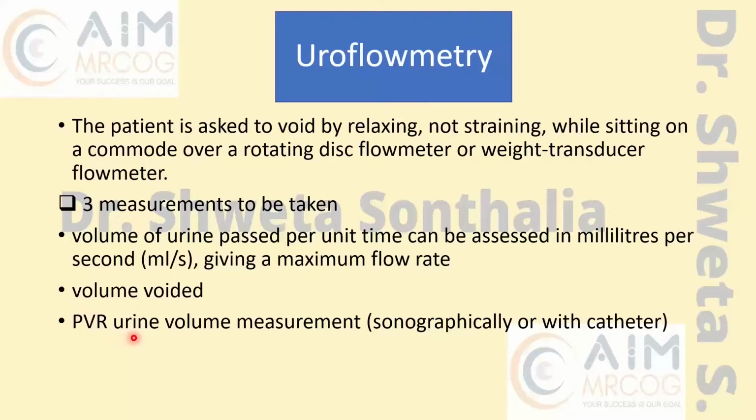Then you will measure her residual volume, which can be done either ultrasonically or with the catheter. Because catheter is invasive, you can go for ultrasound. But whenever you find a significant residual urine, then you have to reconfirm it with the catheter. So this is how it goes.